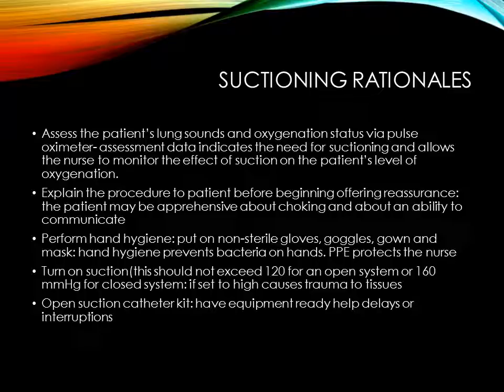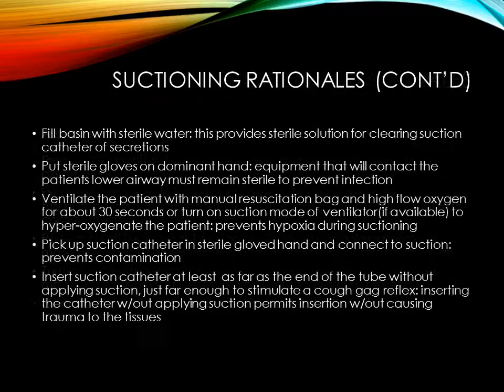Open the suction catheter kit. Having equipment ready helps prevent delays or interruptions. Fill basin with sterile water. This provides sterile solution for clearing suction catheter secretions. Put sterile gloves on the dominant hand. Equipment that will contact the patient's lower airway must remain sterile to prevent infection.